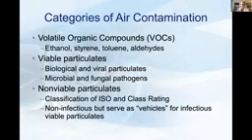As Jacques mentioned, there are 3 basic categories of air contamination that are critical to IVF: your VOCs, your viables, and your non-viables. Your non-viables are probably the least impactful to the human embryo, but necessary to control, because although they're non-infectious, they can serve as vehicles, if you will, for the infectious viable particulates that therefore attach and remain airborne.